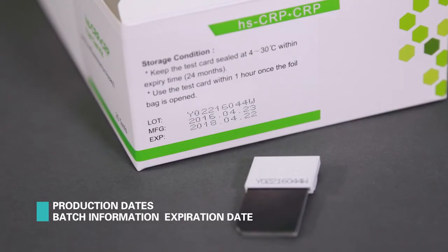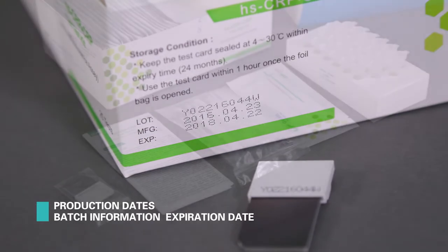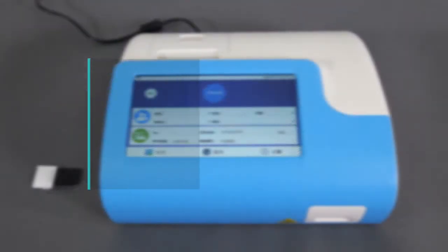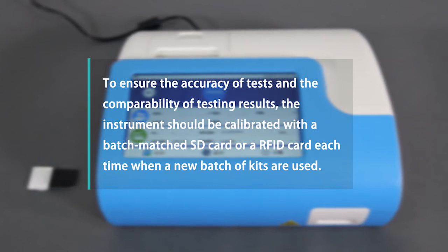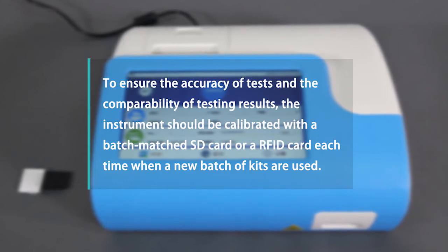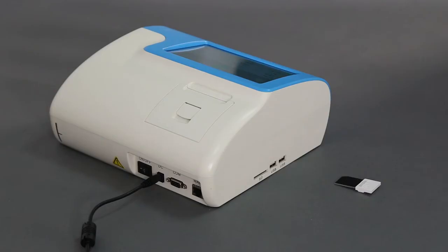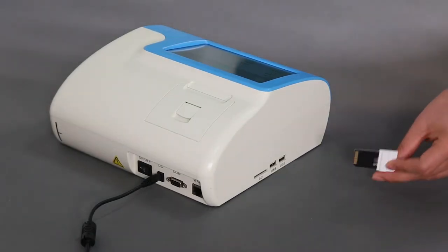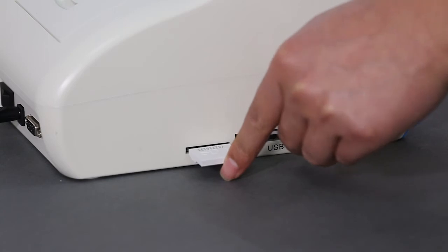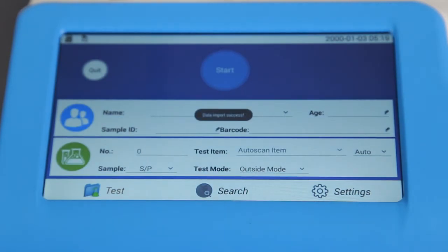Production dates, batch information, and expiration date are labeled on the side of the packaging box. The test card must be used within one hour after opening. To ensure the accuracy of tests and comparability of testing results, the instrument should be calibrated with a batch-matched SD card or a RFID card each time a new batch of kits is used. Insert the SD card into the slot or place the RFID card at the identification area and press OK to upload the data.